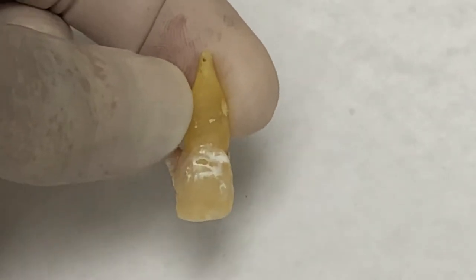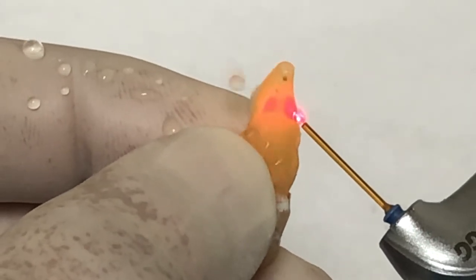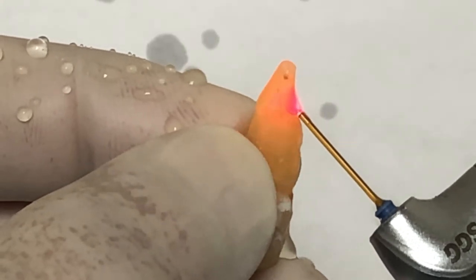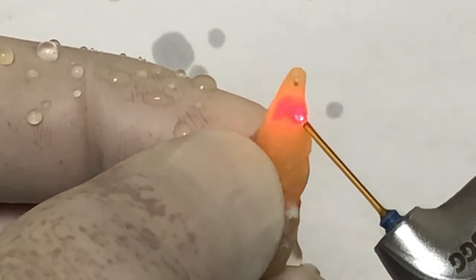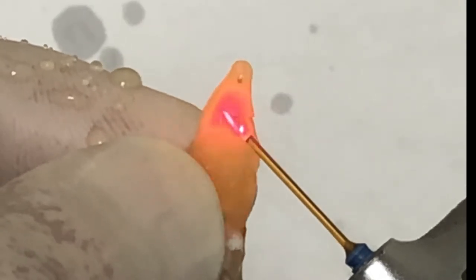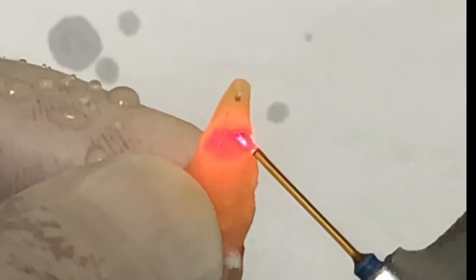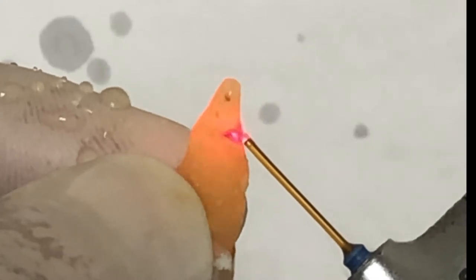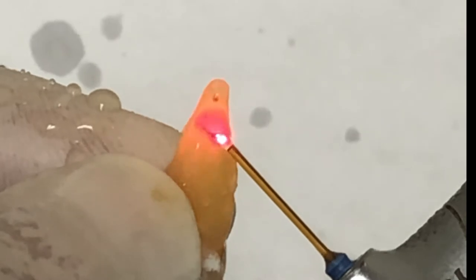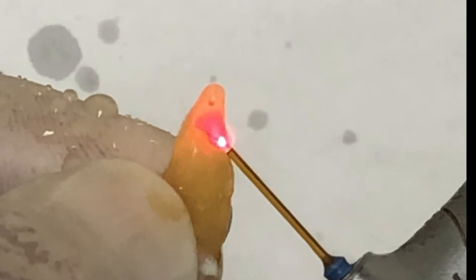What follows is an actual demonstration of an apicectomy and apical seal on an extracted tooth, just to give you an idea of how efficiently the laser performs this task. I will be demonstrating two tips: one is a longer disposable tip called the MZ-6, which may be easier to access the surgical area, and the second one is the MX Turbo tip, which is more powerful and is used with a turbo handpiece. Enjoy the show.